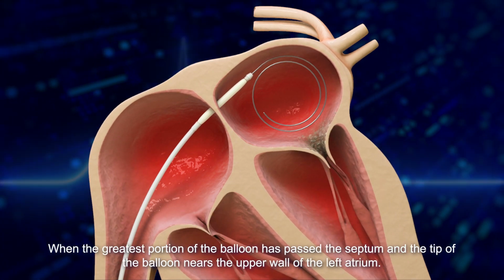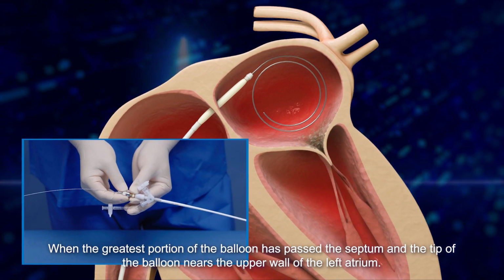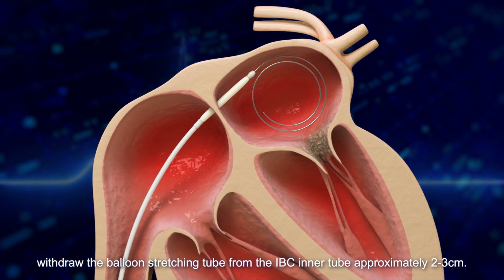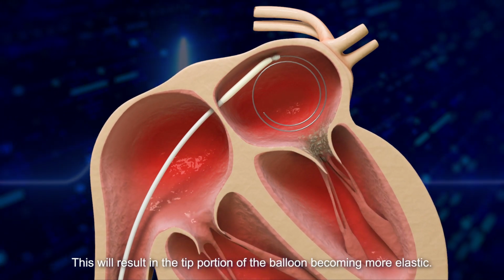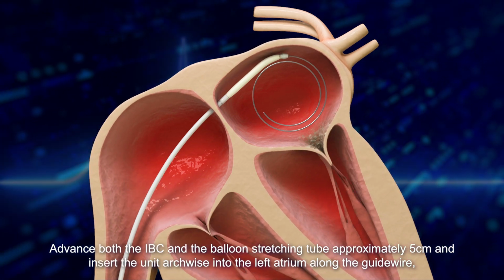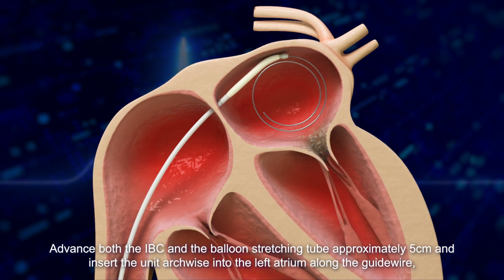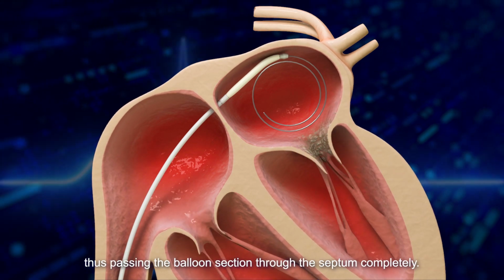When the greatest portion of the balloon has passed the septum and the tip of the balloon nears the upper wall of the left atrium, withdraw the balloon stretching tube from the IBC inner tube approximately 2 to 3 centimeters. This will result in the tip portion of the balloon becoming more elastic. Advance both the IBC and the balloon stretching tube approximately 5 centimeters and insert the unit archwise into the left atrium along the guidewire, thus passing the balloon section through the septum completely.